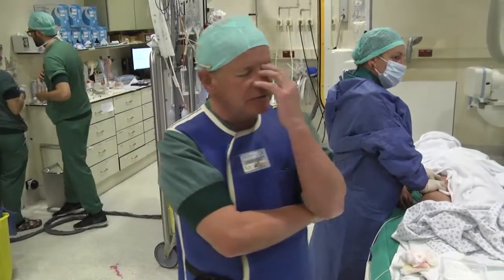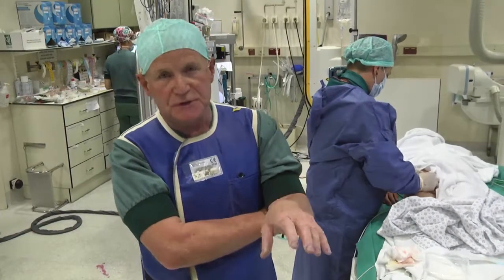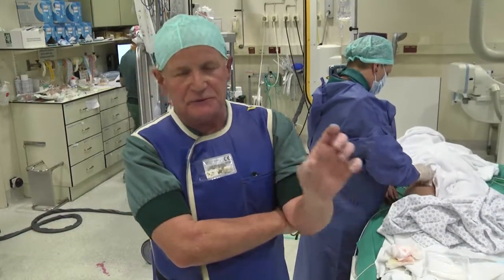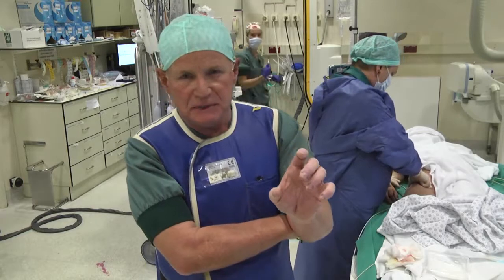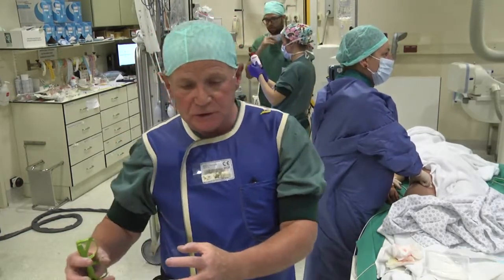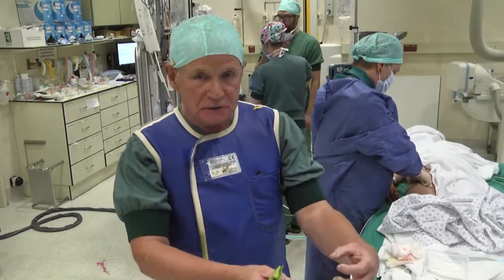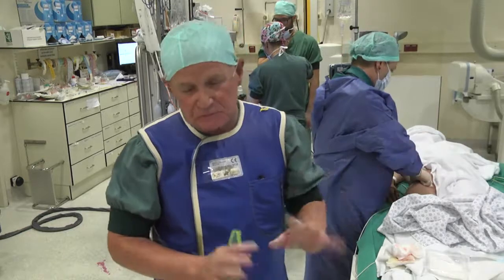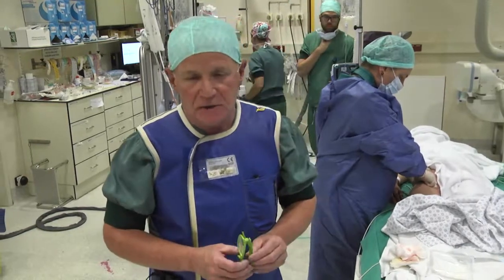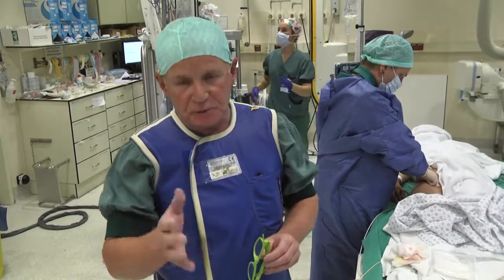Yes, but as a matter of fact, when I checked it, the melody was reasonably well positioned on the balloon. What I saw was that the markers are on the shaft, and the whole balloon system had shifted forwards. The melody had not shifted on the balloon. So I think it was probably still good enough, but I felt more secure by checking it and looking for the markers. But point taken.